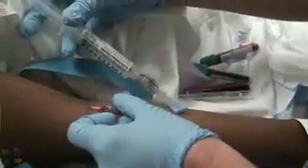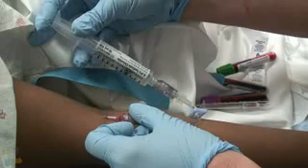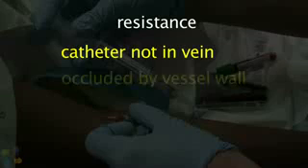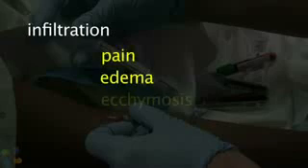After blood draw, flush the catheter with 5 cc's of saline. The saline flush should flow smoothly into the catheter. If resistance is felt, the catheter may not be in the vein, or it may be occluded by the vessel wall, a valve on the vein, or a kink in the catheter. Observe for any evidence of infiltration, such as pain, edema, or ecchymosis.